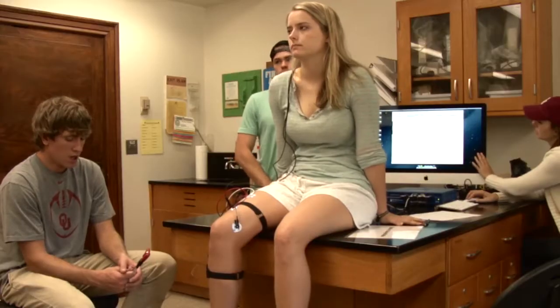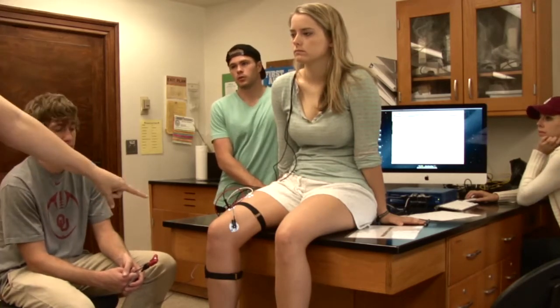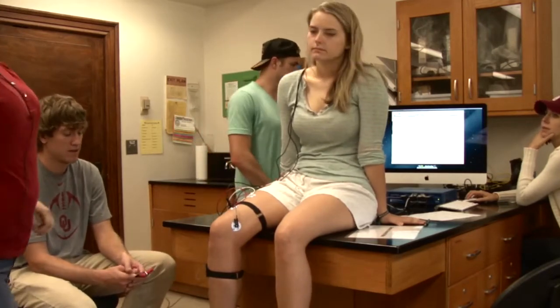When the striker hits the knee you're going to have a reaction and you'll see the goniometer displace. We want that to get back down to baseline and stay at baseline for a few seconds before you give the thumbs up. The hammer operator should not watch the screen — focus on the spot, and when you get the thumbs up, it's time to go.